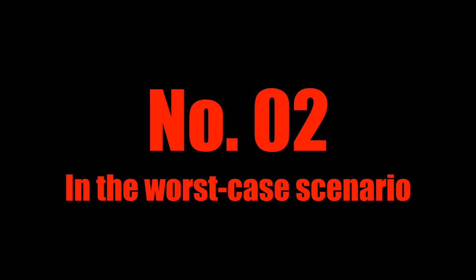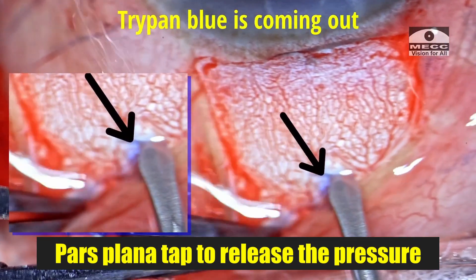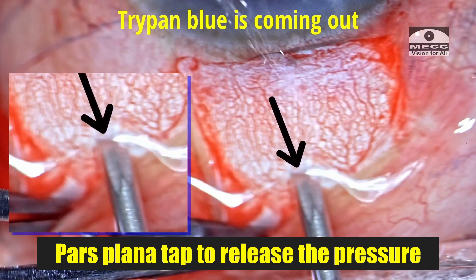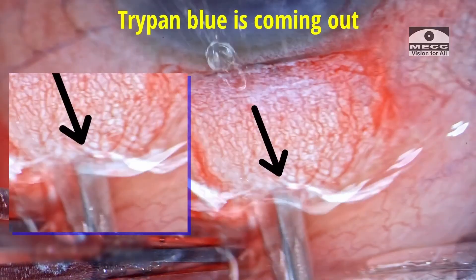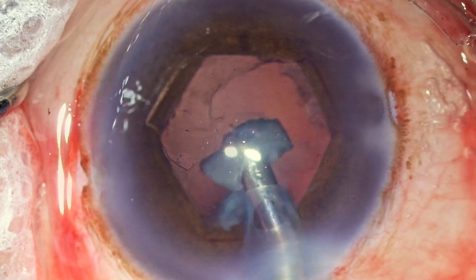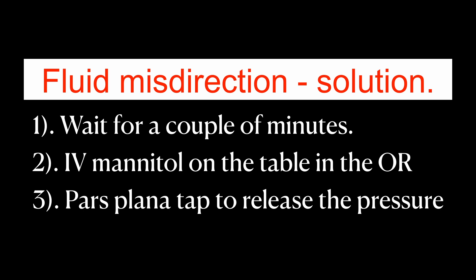In the worst case scenario, if waiting doesn't work, I would start IV mannitol on the table itself and wait for the eye to soften. The third option would be to do a pars plana tap — no need for any anterior vitrectomy, just a pars plana tap to give an exit route to the fluid accumulating behind the Berger's space. That would be my third option as it is an extra intervention. Nevertheless, these are the three options, but most often just waiting for a few minutes does the job. Then you go in, fill in OVD, push the nucleus up anteriorly, and perform emulsification. One has to memorize these three steps when faced with suspected fluid misdirection — if your mind is well prepared, you will come out victorious in such a situation.